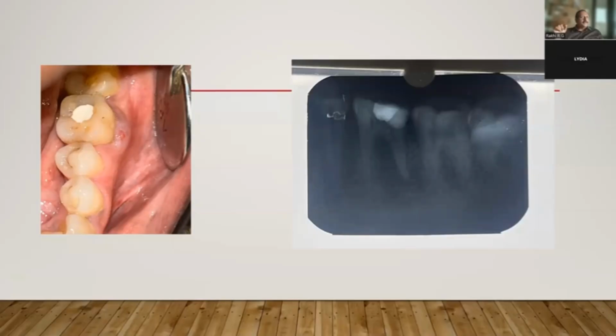I don't think you've done it here. You've done it? That should have been done. Or even for today's case, before you start off whatever your planning is, you can confirm it before that. So insert a GP cone and find out which is the area from where the pus or abscess starts forming. Or is it directed towards the periapex? If it is directed towards the periapex, then the bone loss will be still more.